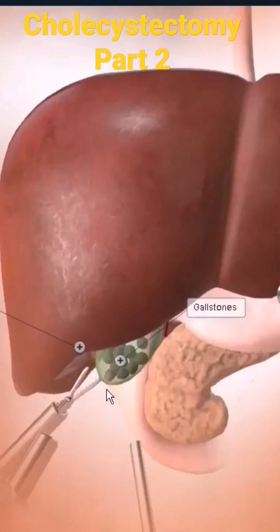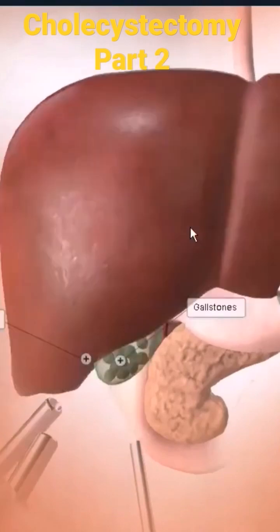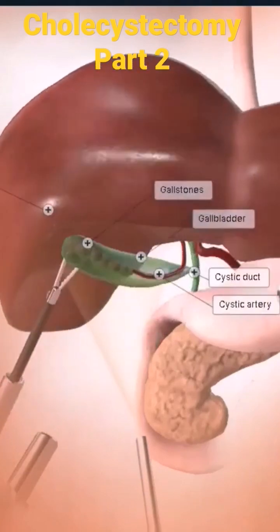You can see how they're using this forceps and they're lifting the gallbladder upwards to expose it. You can see nicely how the cystic artery is going alongside the gallbladder. Making it visible allows easy ligation of the artery as well as the cystic duct.